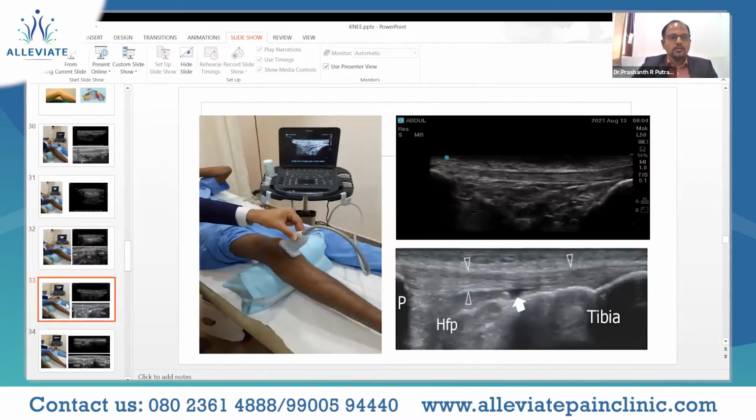Moving to the next area, the infrapatellar area. From this portion we have moved down below the inferior pole of the patella. Now we are seeing the patellar tendon portion, this nice thick band over here, extending from the inferior pole of the patella towards the anterior portion of the tibial tuberosity.